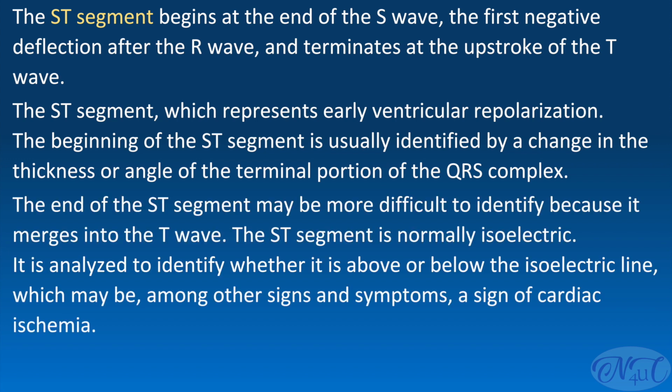The end of the ST segment may be more difficult to identify because it merges into the T wave. The ST segment is normally isoelectric. It is analyzed to identify whether it is above or below the isoelectric line, which may be, among other signs and symptoms, a sign of cardiac ischemia.